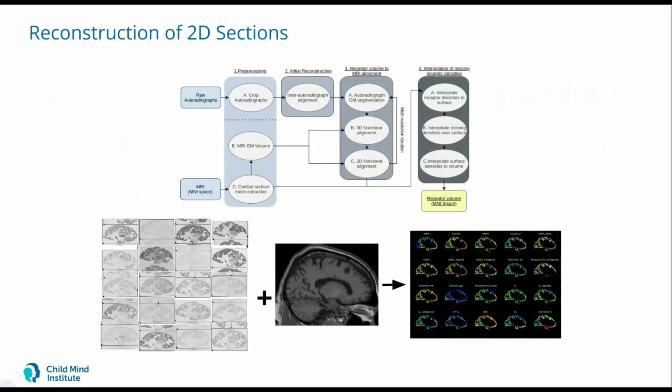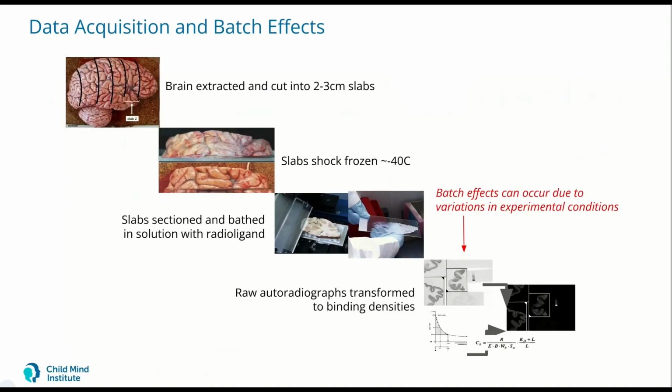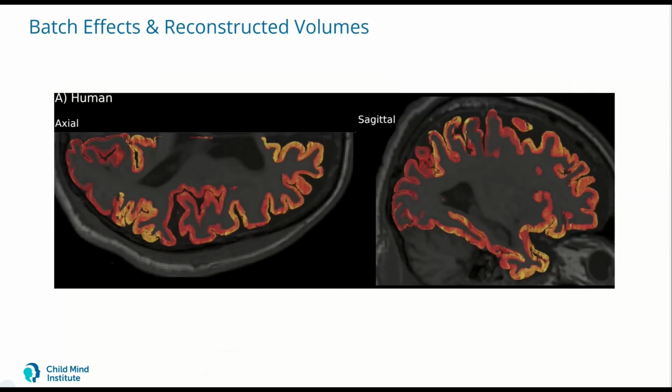Now the project is to take these 2D sections and put them into 3D, and to do that we developed a pipeline which does this quite effectively. The only problem is that once we had reconstructed the 3D images, we saw that there were batch effects that had been introduced. Probably related to the incubation of the sections in the radioligand, there are mean shifts between different batches of tissue. And so you can see that here.